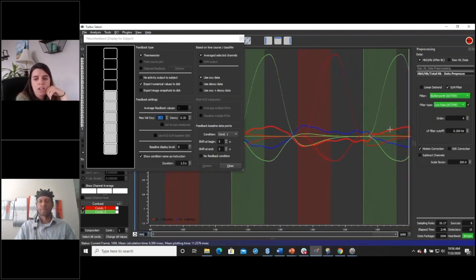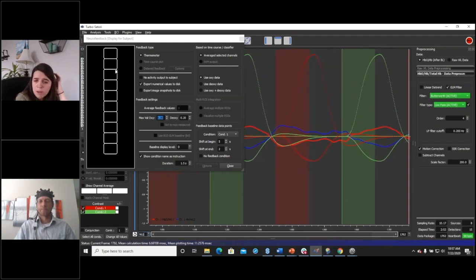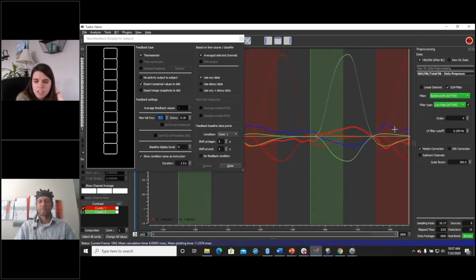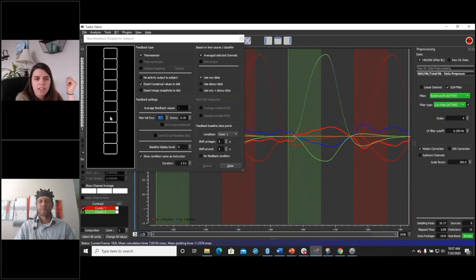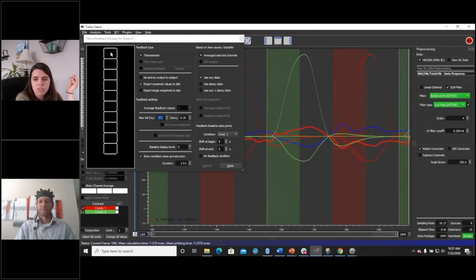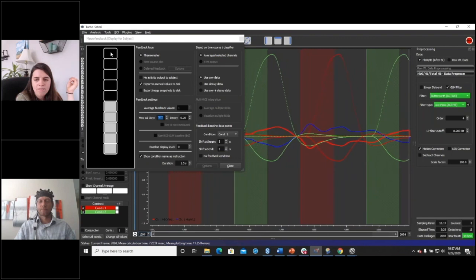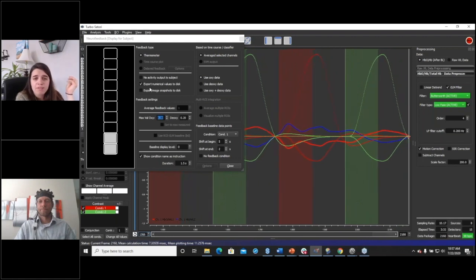Okay, so this condition started again, and we did see another increase in oxy and a consequent increase in the thermometer. Now let's look for this again. This is another left-hand condition, and so we're not really seeing activation. Deoxy is actually up, and oxy is down. And now we'll have the final right-hand condition. Look here for the thermometer to increase as this condition really takes hold. Okay, and there we have it.